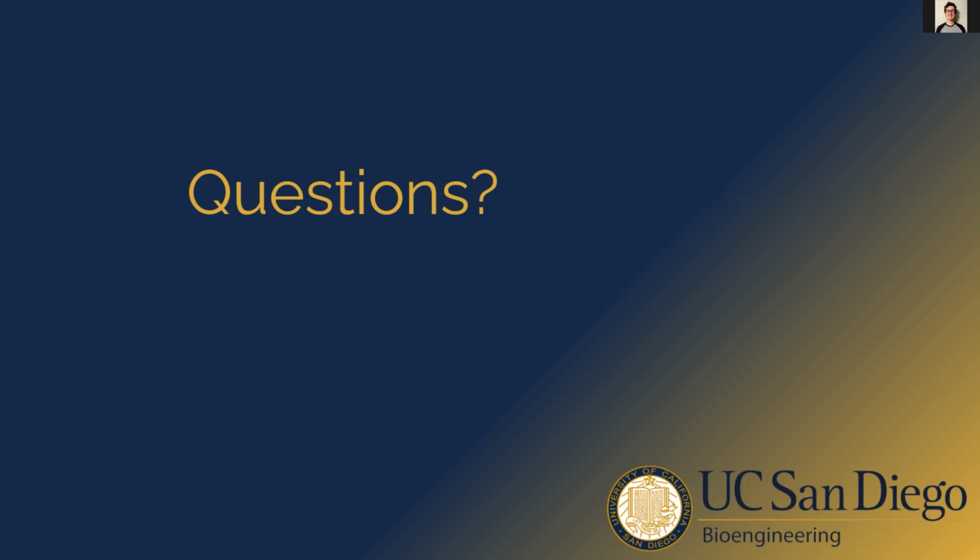Good question. We actually went through a few different methods to get that to work. And the one we landed on that was most computationally efficient and let us do it easily was we would just do a normal Fourier transform. Let's take a simple example, 2.5 acceleration, in which case we would take the middle 50% of the region. So if we were just working in ky, it would be that 50% band down the middle.